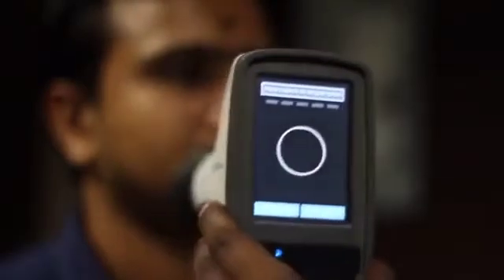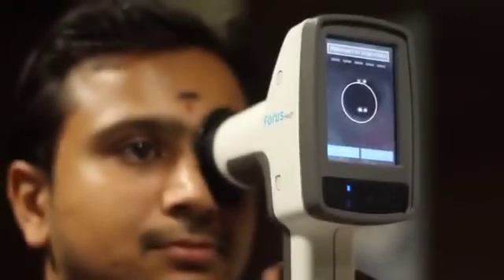Similarly, to take the left eye image, I'll show the demo once again with the left eye. Pressing the left option, again I'm aligning the circular grid with the pupil using the four dots.